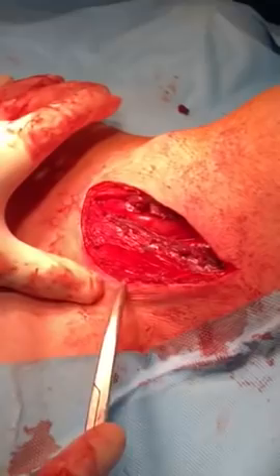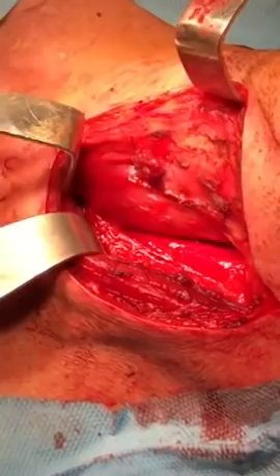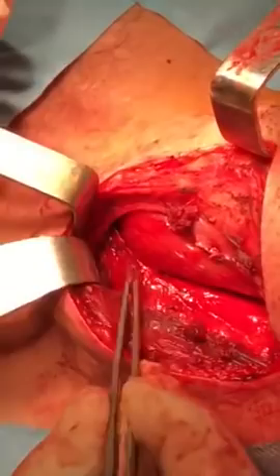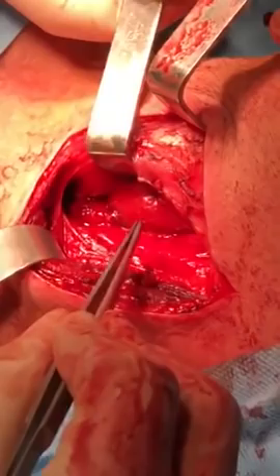The skin, subcutaneous tissue, and platysma have been incised. The anterior border of sternomastoid is incised and freed, and then the omohyoid muscle is transected. This is the medial border of the omohyoid and this is the lateral border. We can repair this later. The carotid sheath is lateral and the thyroid, trachea, and esophagus are medial.